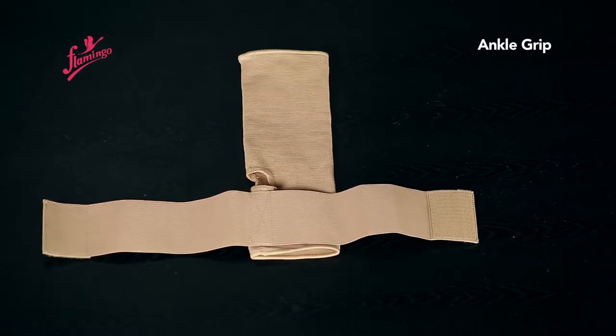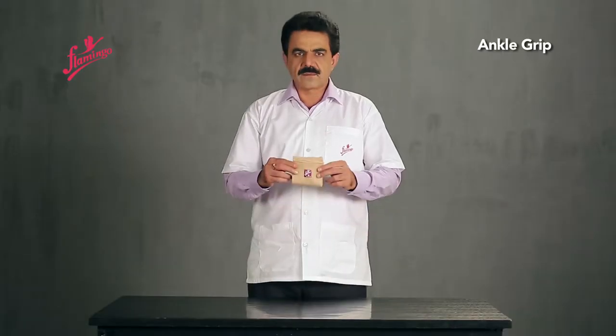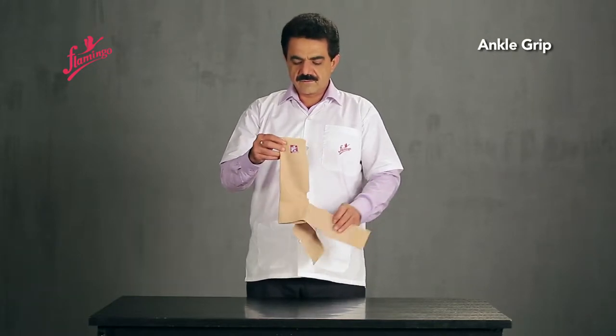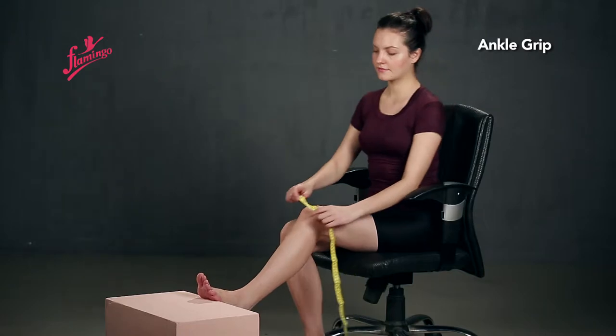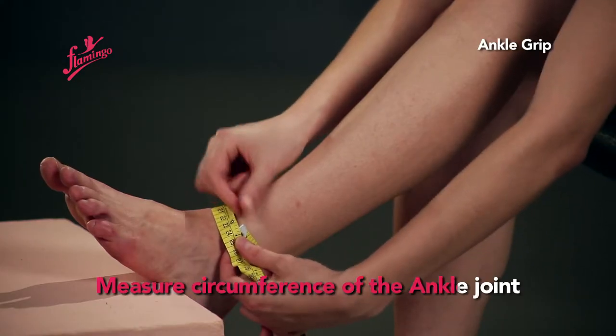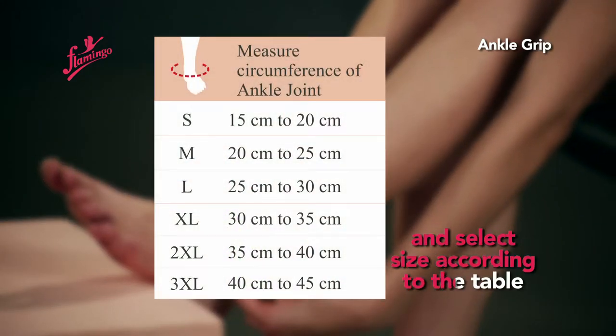Ankle Grip. Measure the circumference of the ankle joint and select the appropriate size according to the sizing table.